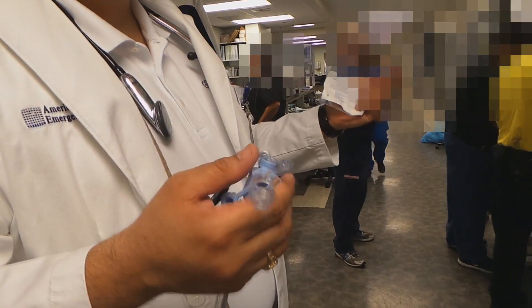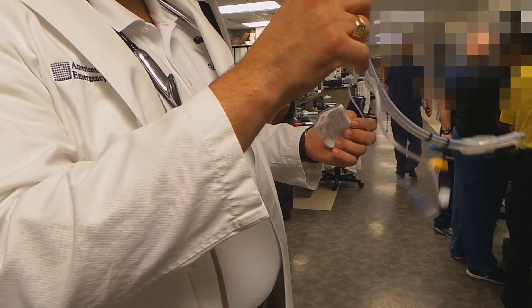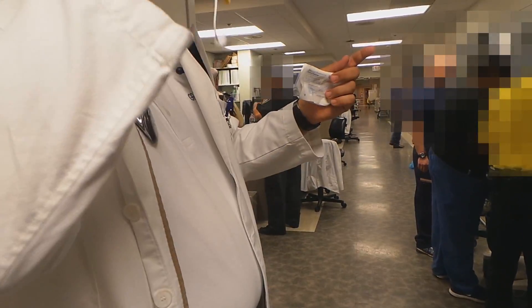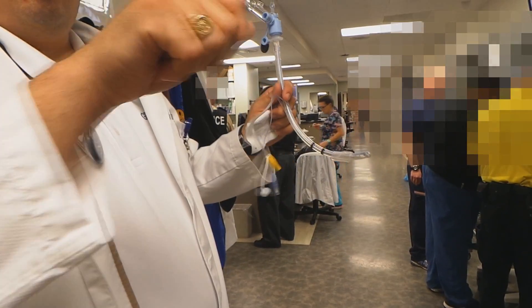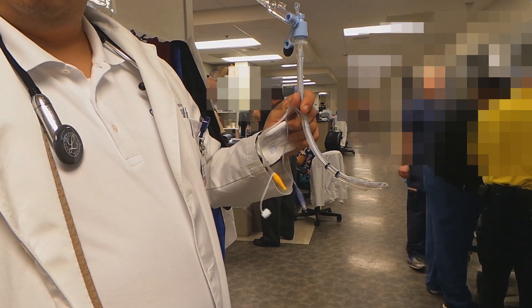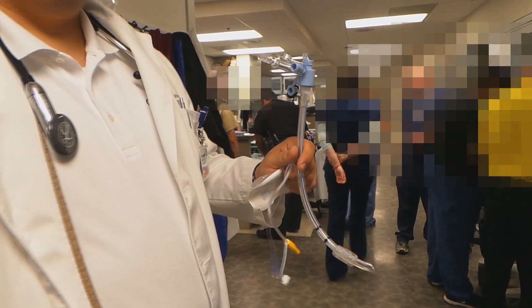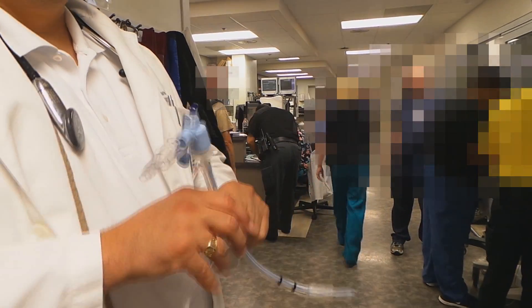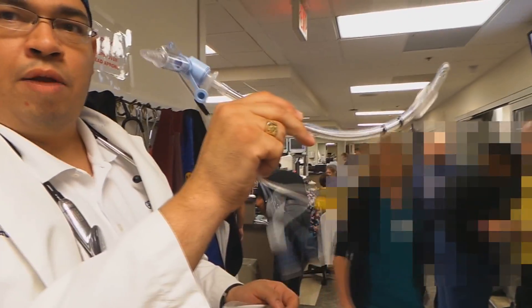So if you have somebody that has massive hematemesis, lots of blood in the airway, lots of gunk in the airway — you're suctioning as you go. That way, when you get your view, you can just go ahead and pass the tube. As opposed to normally where you're suctioning, suctioning, suctioning — once you get your view you take your suction out, look down for a second to get your tube, and when you look back up you've lost your view and you have more blood in the airway. This way, you can continuously suction until you get your view, and then you're ready to just go ahead and pass the tube.